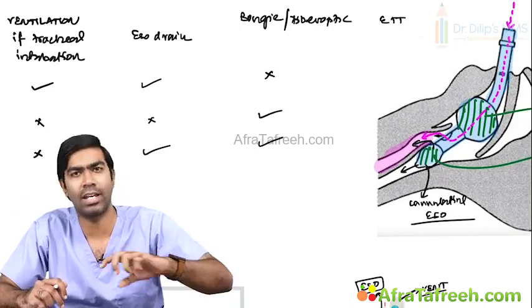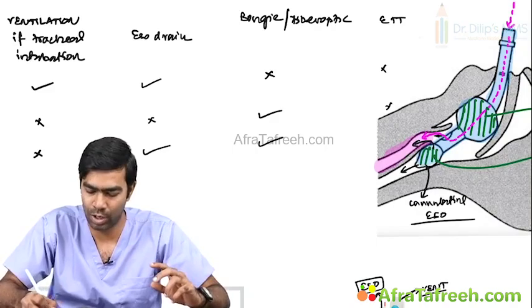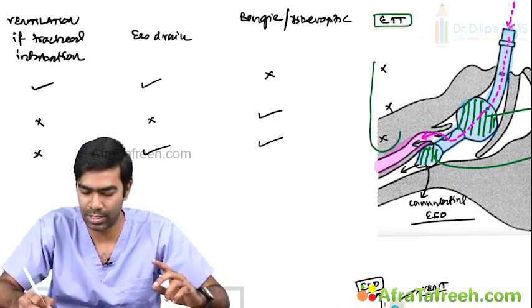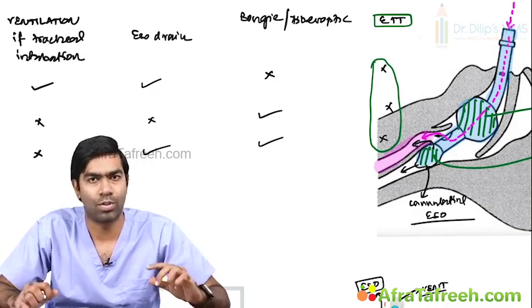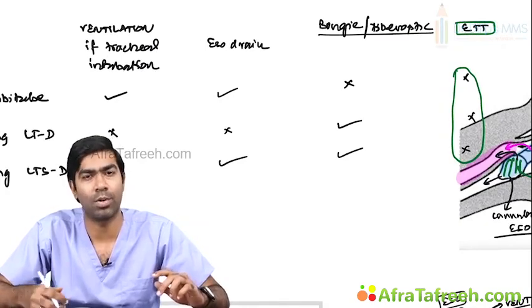Whether they can fit an entire endotracheal tube through the lumen of the ventilatory port? No, none of these can support the endotracheal tube. Even a 6.5 tube cannot be supported. Clear? So this is one of the basic disadvantages of the laryngeal tubes. They cannot support the endotracheal tube through the ventilatory port at all. But they still can aid in intubation by supporting the fiber optic scope.